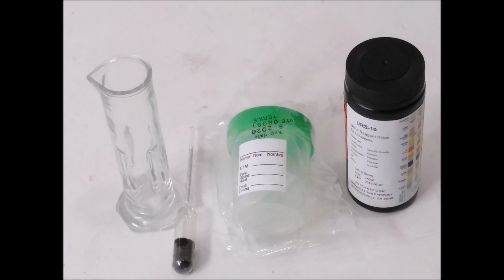The first test we'll be performing today is the specific gravity test. What specific gravity measures is the concentration of solutes or dissolved solids in the urine. How it does this is it measures the urine density when compared with water. The specific gravity test provides us insight into the ability of the patient's kidneys to concentrate urine.